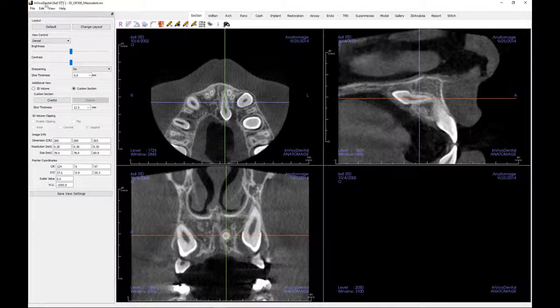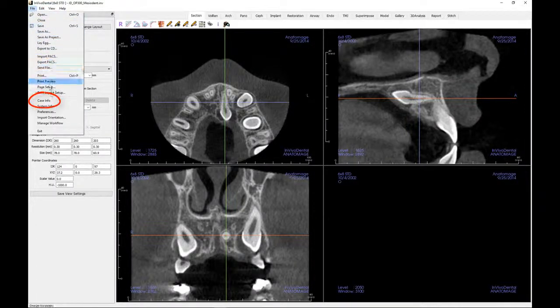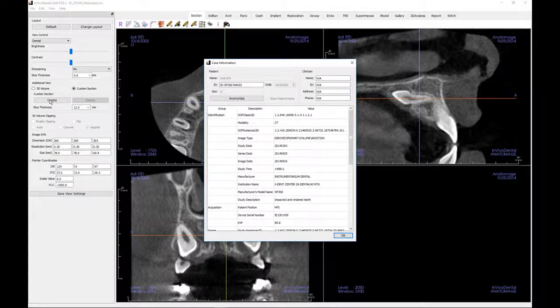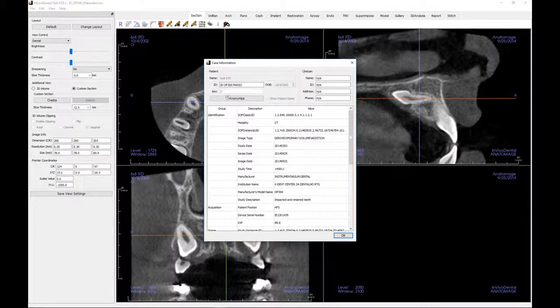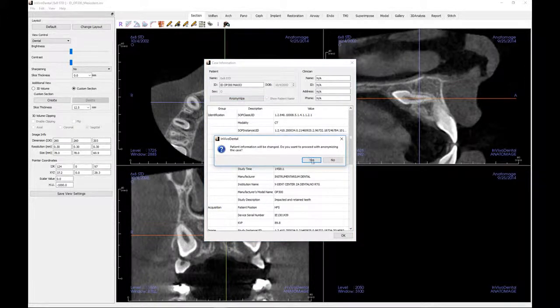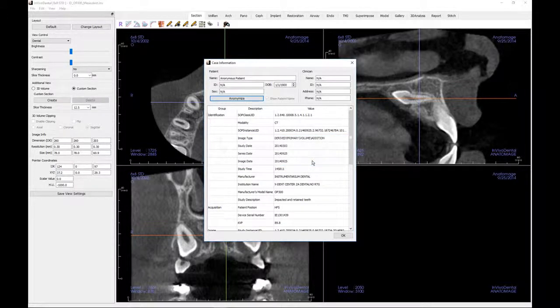Let's take a quick look at the sources of the displayed text. At the top left of the viewing windows, the patient name, ID, and their gender is pulled from the Case Info tab in the File section of the menu bar. This is also the source of the scan data.